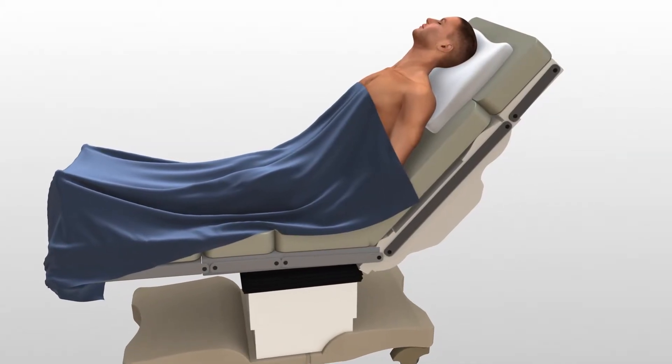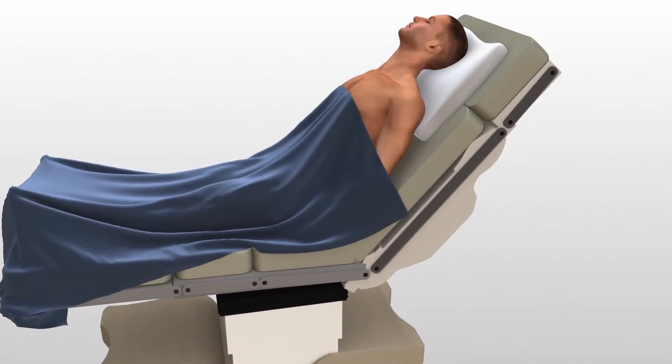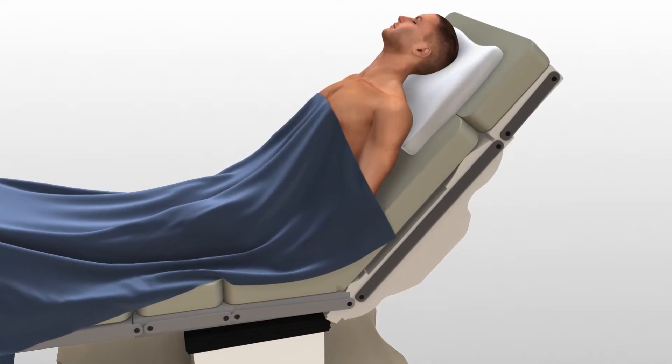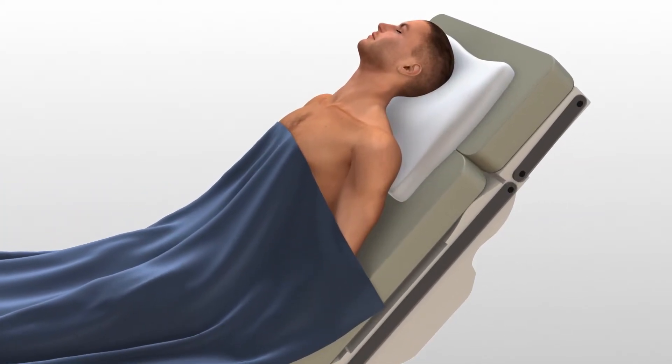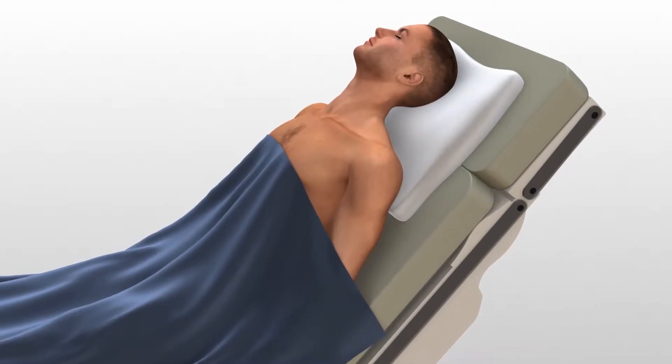After thorough radiographic evaluation has been completed, the patient is placed in a beach chair position. A bolster is placed between the shoulder blades, allowing the injured shoulder girdle to retract posteriorly.